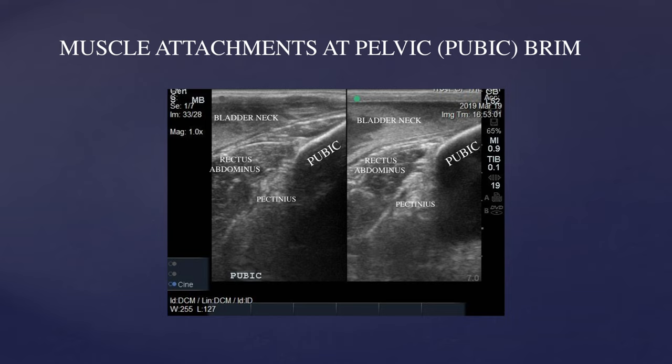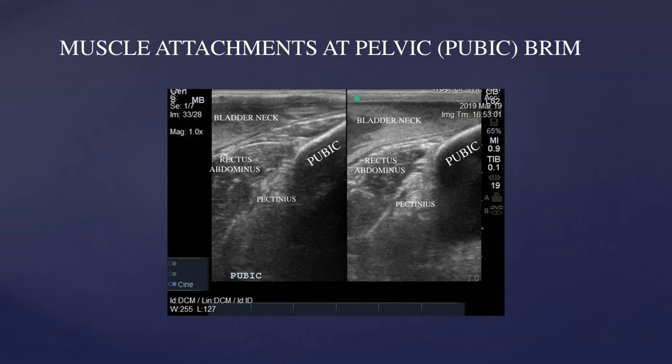Slide seven shows a normal ultrasound appearance of the muscle attachments at the pubic or pelvic brim. You can see the rectus abdominis as it arches off the cranial aspect of the pubis, and the entheses of the pectineus muscle as well. The bladder neck is visible at the very top portion of each of these images, but this is a good normal reference image for these muscle attachments at the pubic brim.